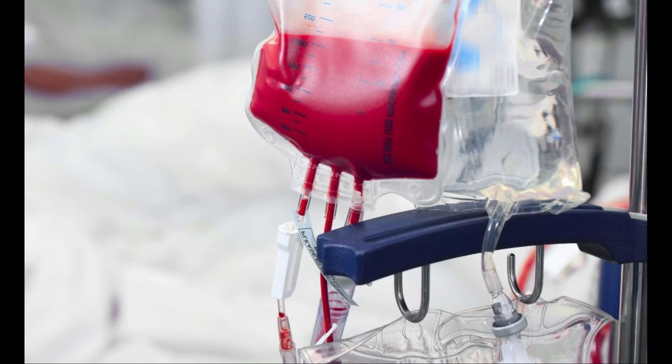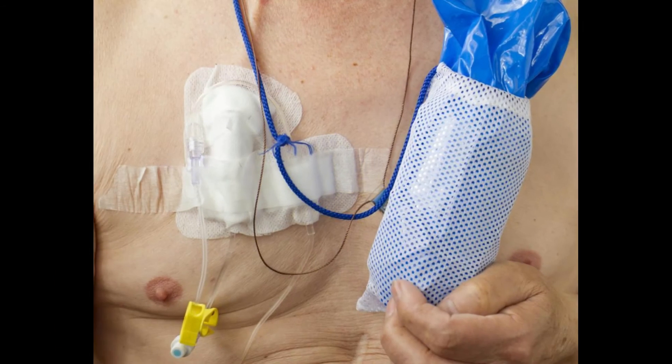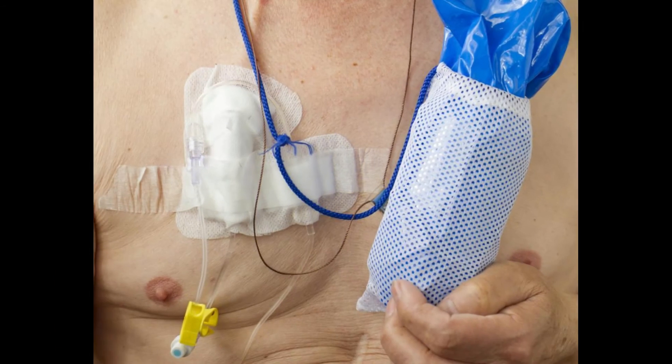The catheter has a unique cuff on the part of the tube that is tunneled under the skin. This cuff contains a special mix of collagen that promotes tissue ingrowth, meaning human tissue will actually grow to the cuff to help hold the catheter in place.